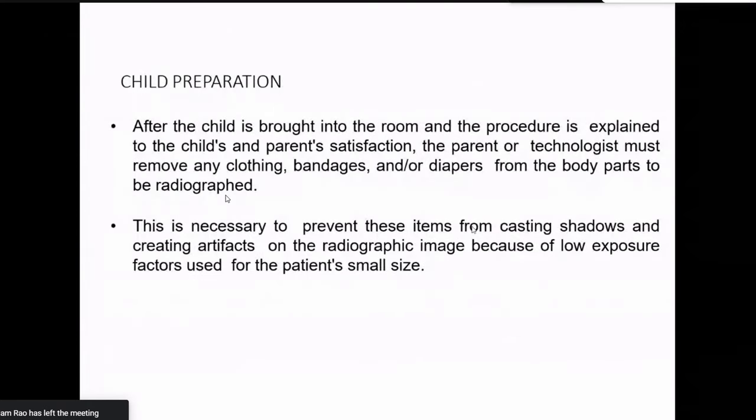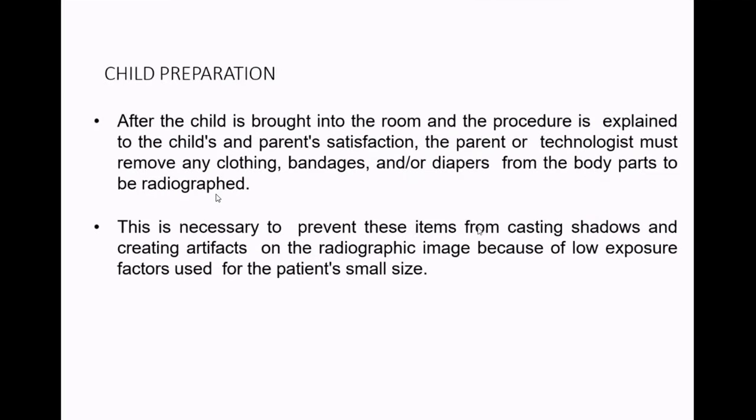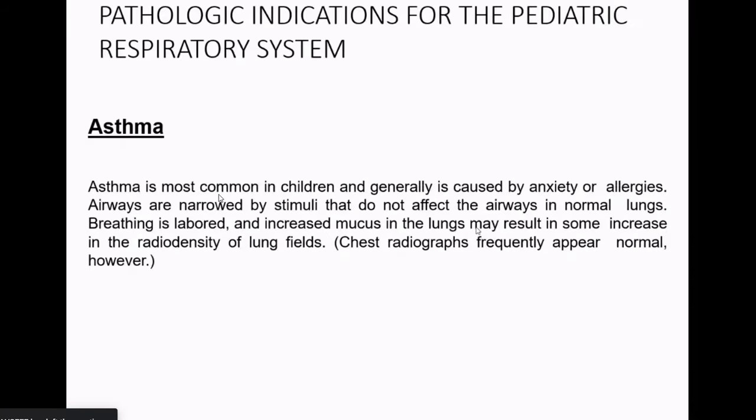Child preparation. After the child is brought into the room and the procedure is explained to the satisfaction of the child or parent, the parent or technologist must remove the clothes, bandages or diapers, if any, near the area of interest. This is necessary to prevent these items from casting shadows and creating artifacts on the radiographic image, because of the low exposure factors and the small size of the patient. Some pathological conditions we must be aware of, so that we can acquire a better image in these conditions.